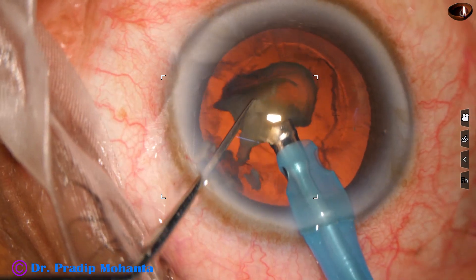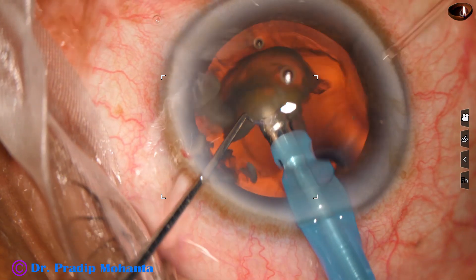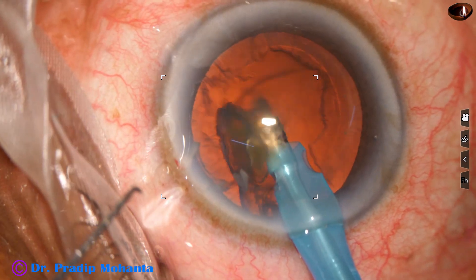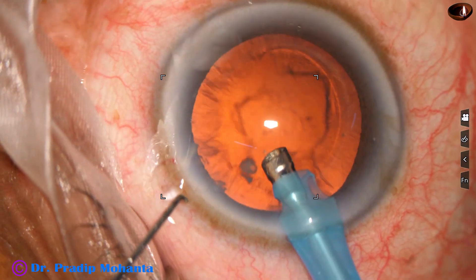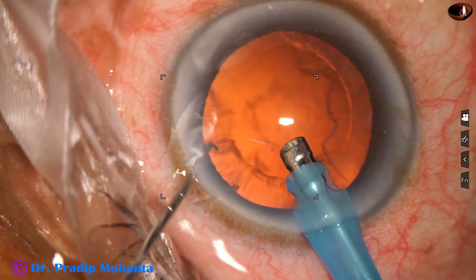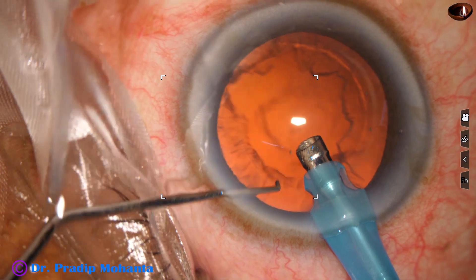At this time we can reduce the parameters to 30 percent power, 30 ml per minute flow rate, and 300 vacuum. Some pieces which are at the side port are removed.